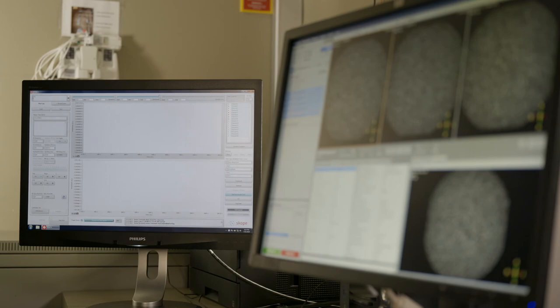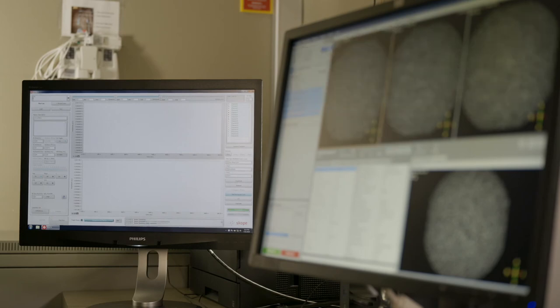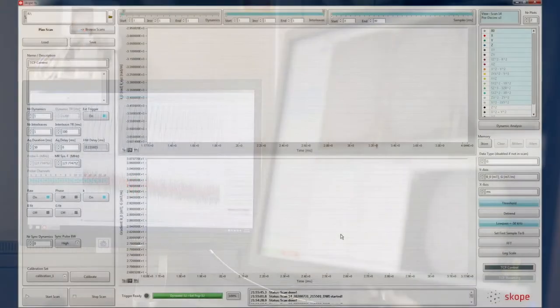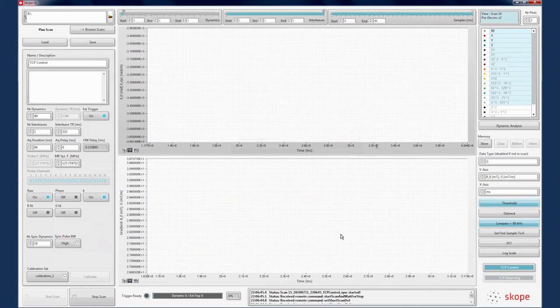We enable the remote acquisition interface and start a scope-aware exam card. We can see the scope system is now under the scanner's control. The values for a DWI spiral scan are populating in the acquisition system. Now we start the scan, and you can see the scope system ready itself and start acquiring. In this way, we can make the process of measuring field dynamics even easier.